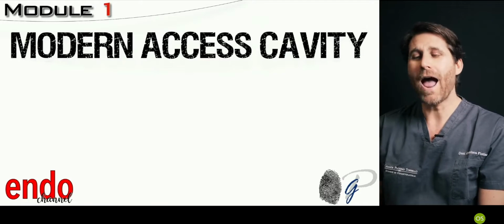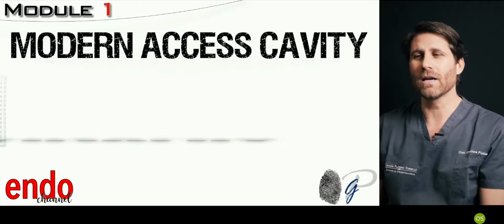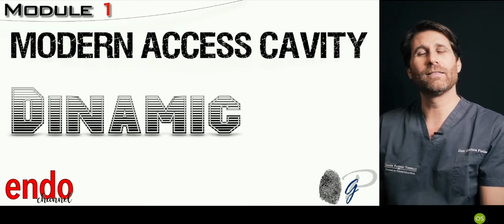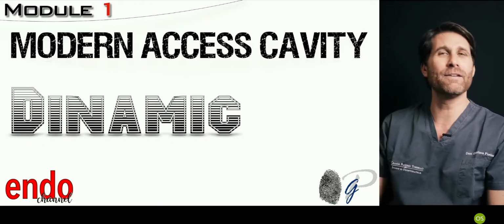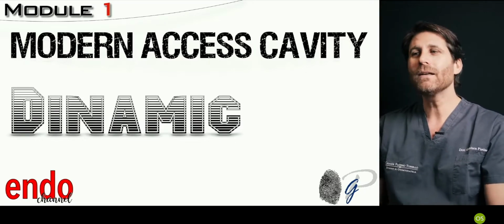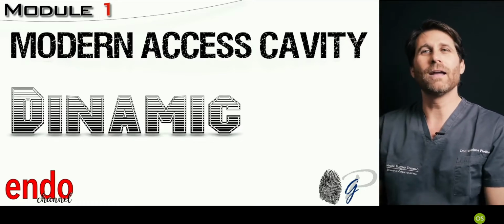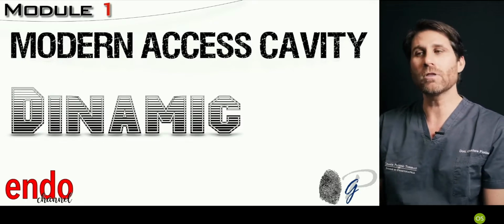The modern access cavity concept that I would like to introduce to you is a dynamic concept. It's something that is not related to drawings in a book that aim to teach us how to open an access cavity with a predefined shape depending on the tooth category, but this modern concept is a dynamic approach to the access cavity preparation, given by the anatomy, the coronal anatomy, but mainly the root anatomy and the root canal anatomy.